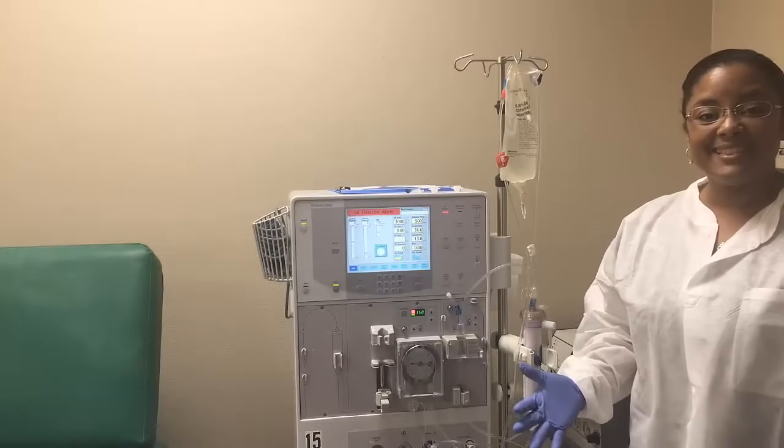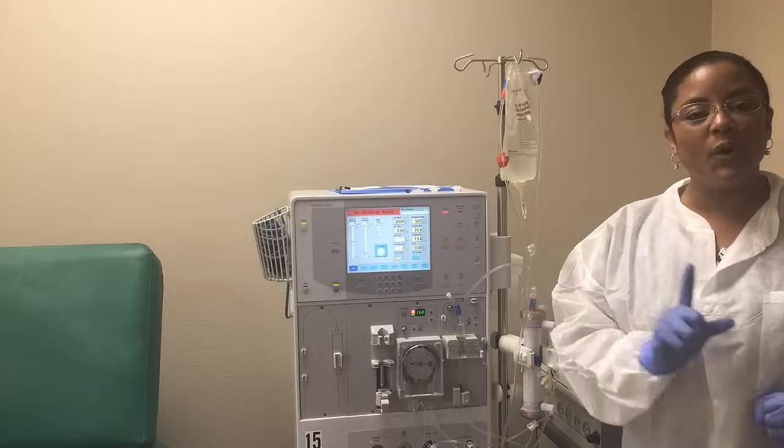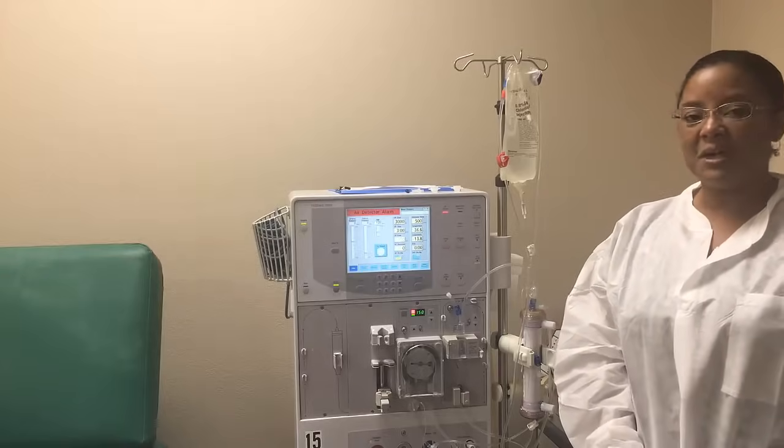This is the end of part one of setting your machine. I hope this has helped.